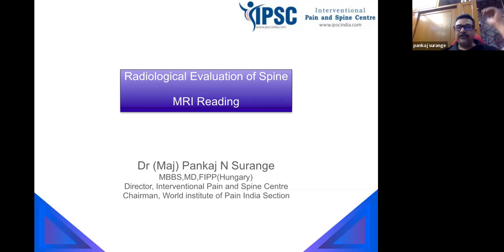So for that, it is better to use the films, start reading the films. Whenever you have a patient who comes to you, even if the patient doesn't have an MRI, what MRI to order is also your responsibility.